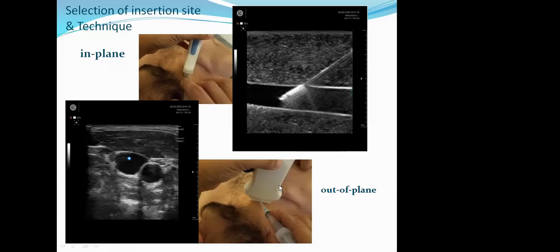When you put your probe in a transverse direction, select the position of the internal jugular vein for puncture where the vein is adjacent to the common carotid artery, not on top of it, because this will avoid accidental puncture. Always remember that the vein should be lying adjacent to the common carotid artery.